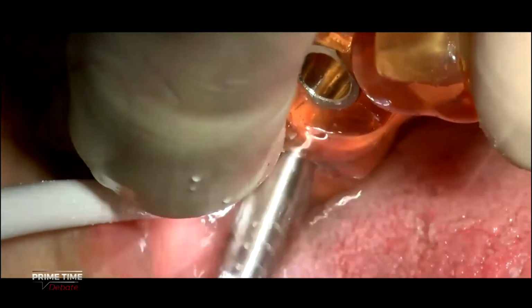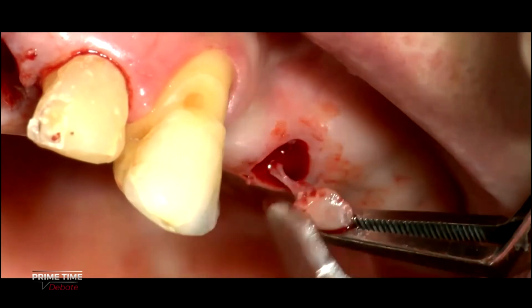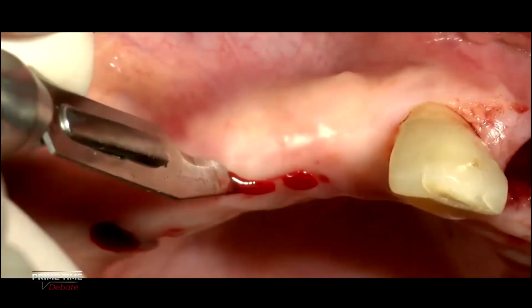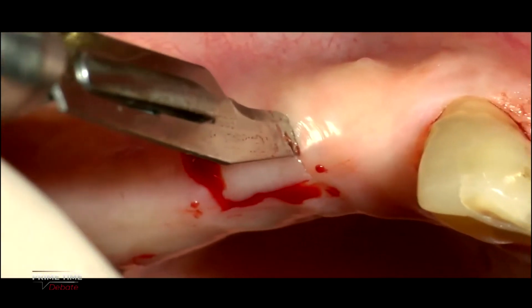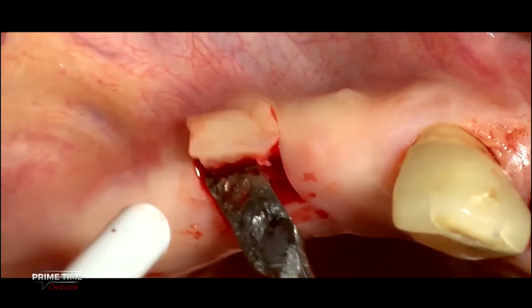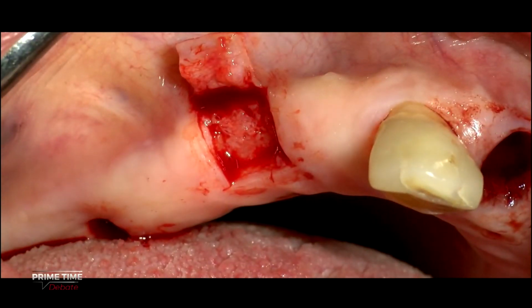In the frontal area it is not the case, so we remove the punch after having cut with the punch drill. Then when we move to this area, thanks to the guide given by the surgical guide itself, we can release a very small flap, so that after the positioning on the vestibular side, we have the implant surrounded on the four sides by keratinized gingiva.